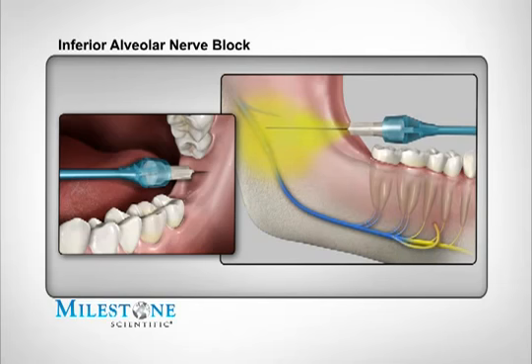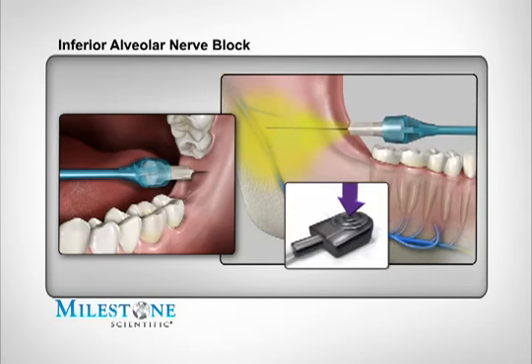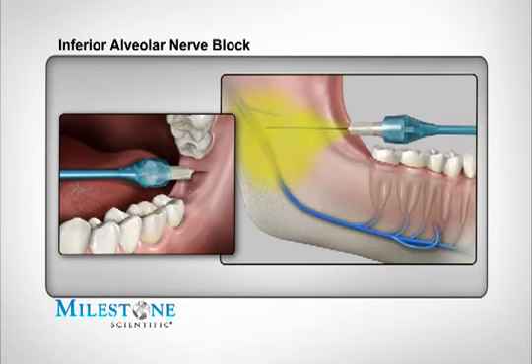It's recommended that the first 1/4 of the cartridge be dispensed using the control flow rate before transitioning to the second, faster rapid flow rate. The rapid flow rate is used during block injections only after your patient has acknowledged that they have achieved soft tissue anesthesia of the area being injected. This is acknowledged by subjective statements elicited from your patient. When you've delivered the required dosage, you can remove the needle.